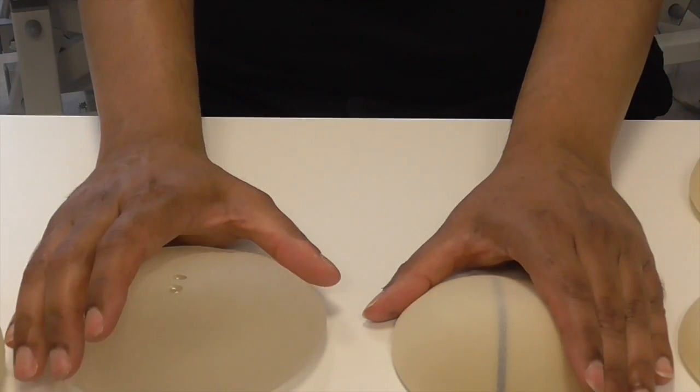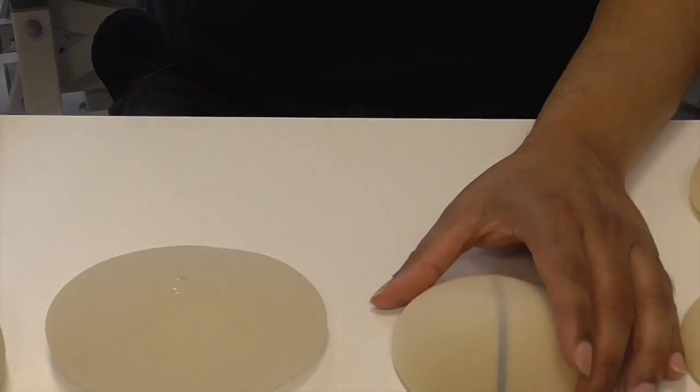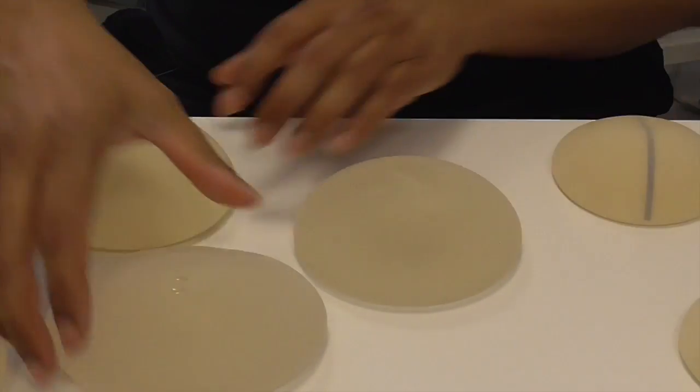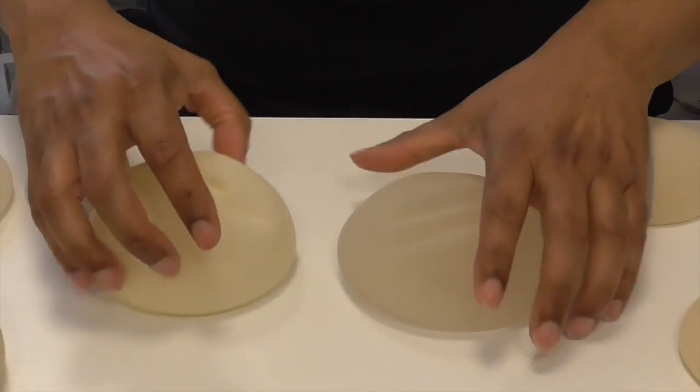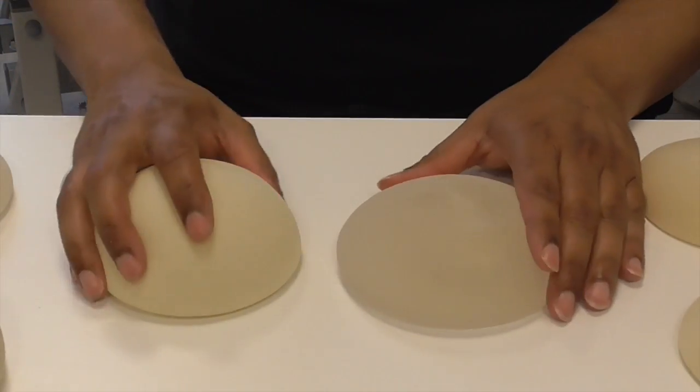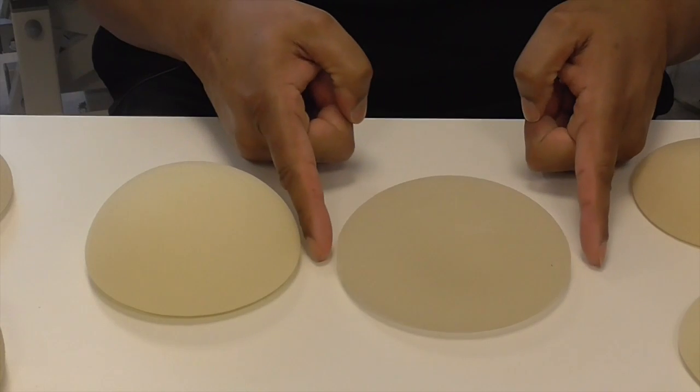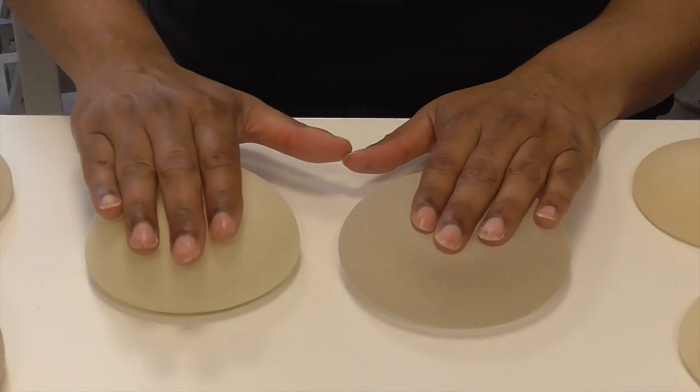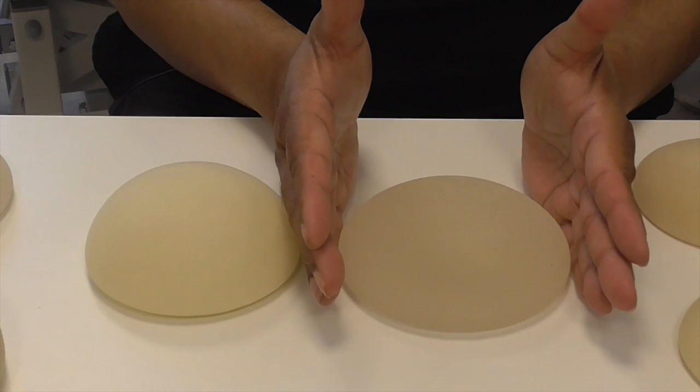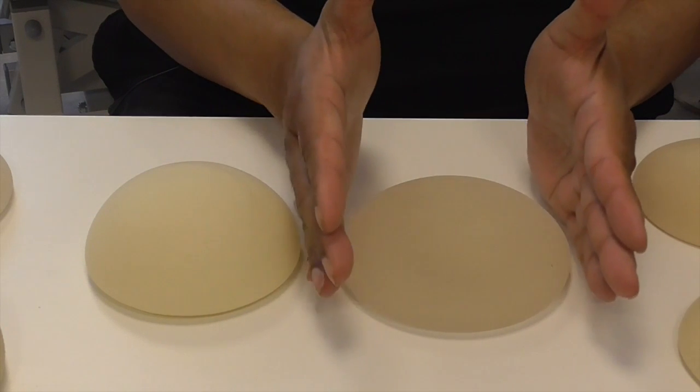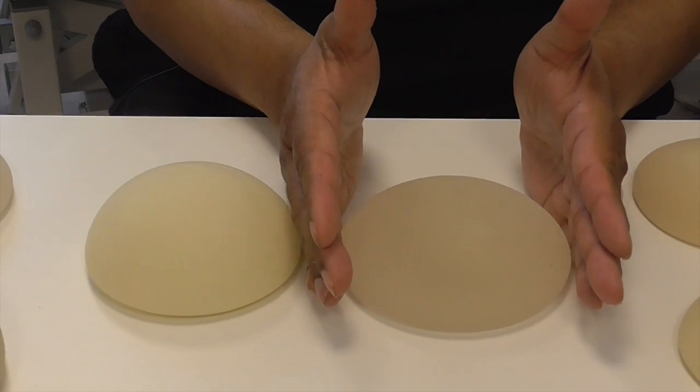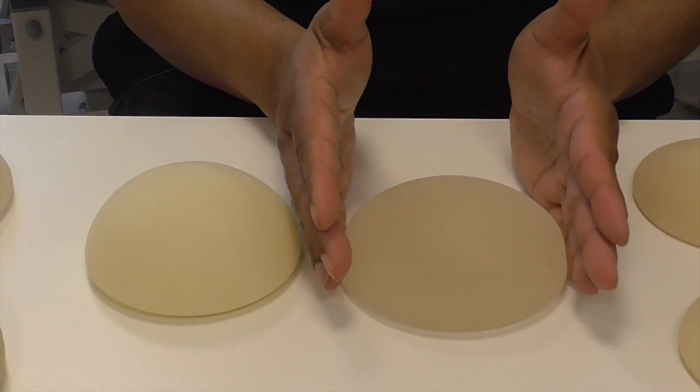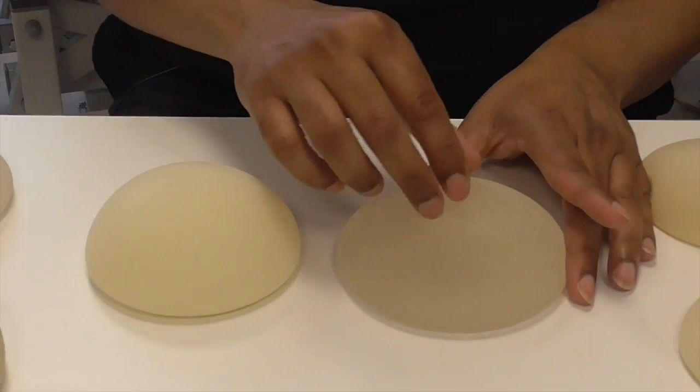The next thing about the implants is that if you look at this implant versus that implant, you see there's a difference in the base of the implants. This is much wider than this, and this is a bit flatter than that. So one has to choose an implant that is bespoke for the patient. You have to measure the patient's breast base and not choose one that is too big or too small.